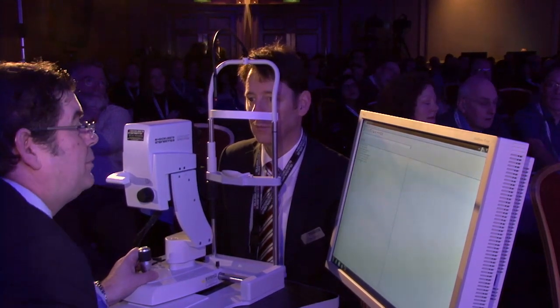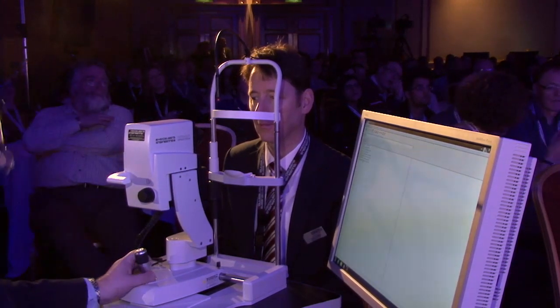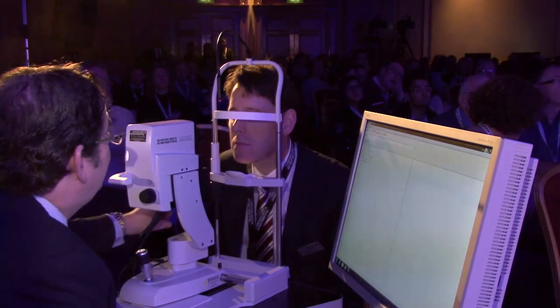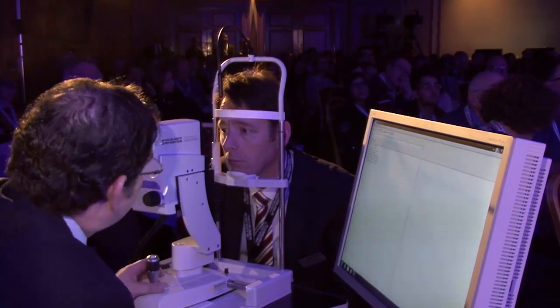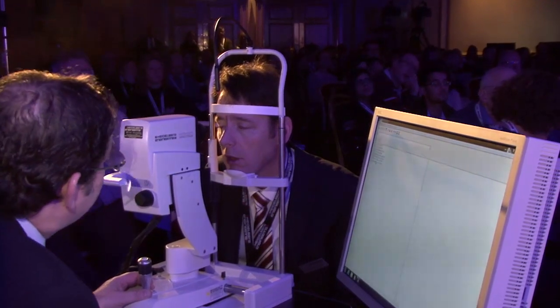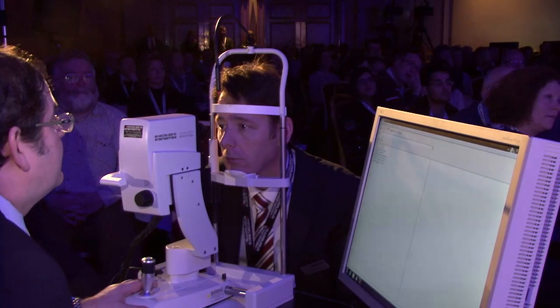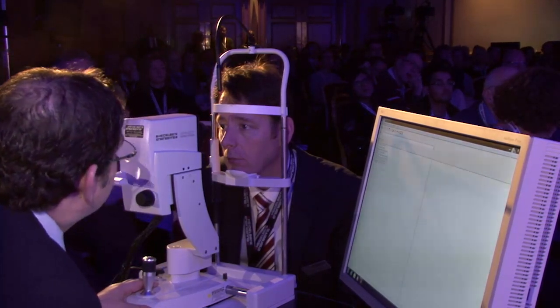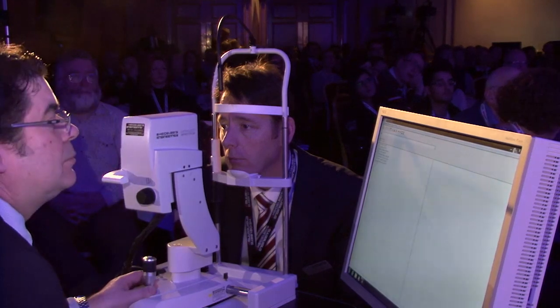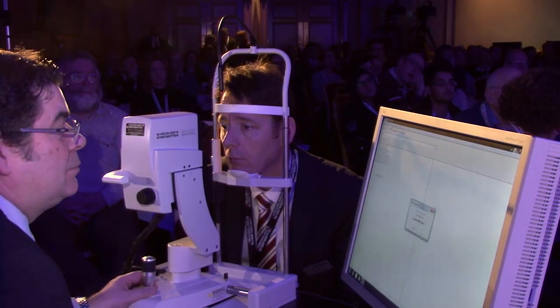Perfect. Okay, so first of all, in trying to set a patient up for any kind of clinical examination, a few moments just getting the patient comfortable and positioned is important, and particularly with OCT, it's very important that the patient maintains a head-forward position throughout the examination. If they don't, they drift away. It's very difficult to maintain an accurate OCT scan position. Okay, if we go over to the live instrument feed now, please.